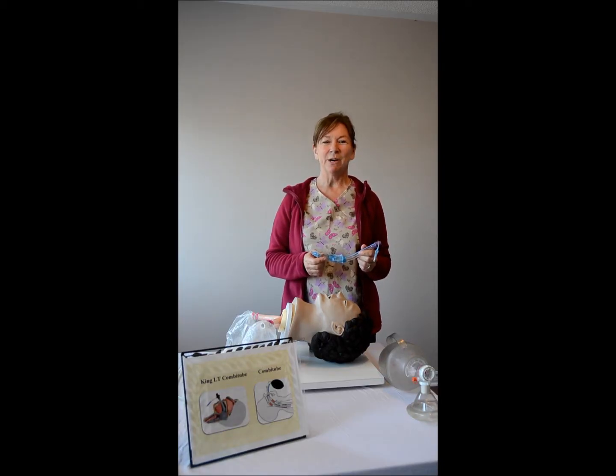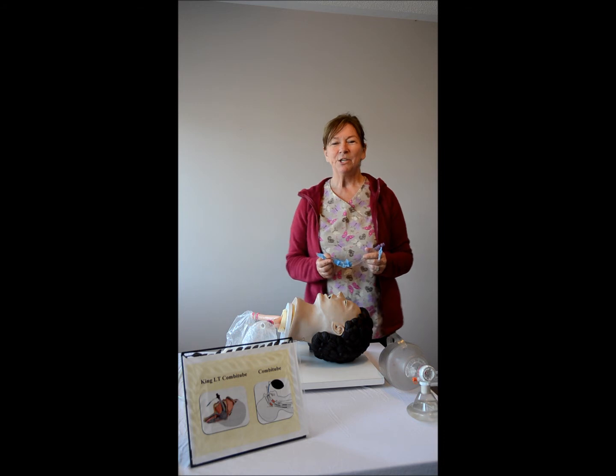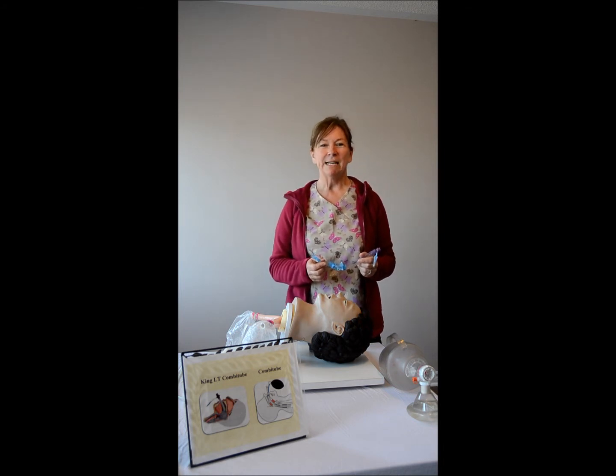Hi, thank you for coming to our last video in the seven-part series titled Airway Management. My name is Darlene Hutton and I am with QRS Educational Services. In this video we will be addressing the King LT, which is considered an advanced airway.